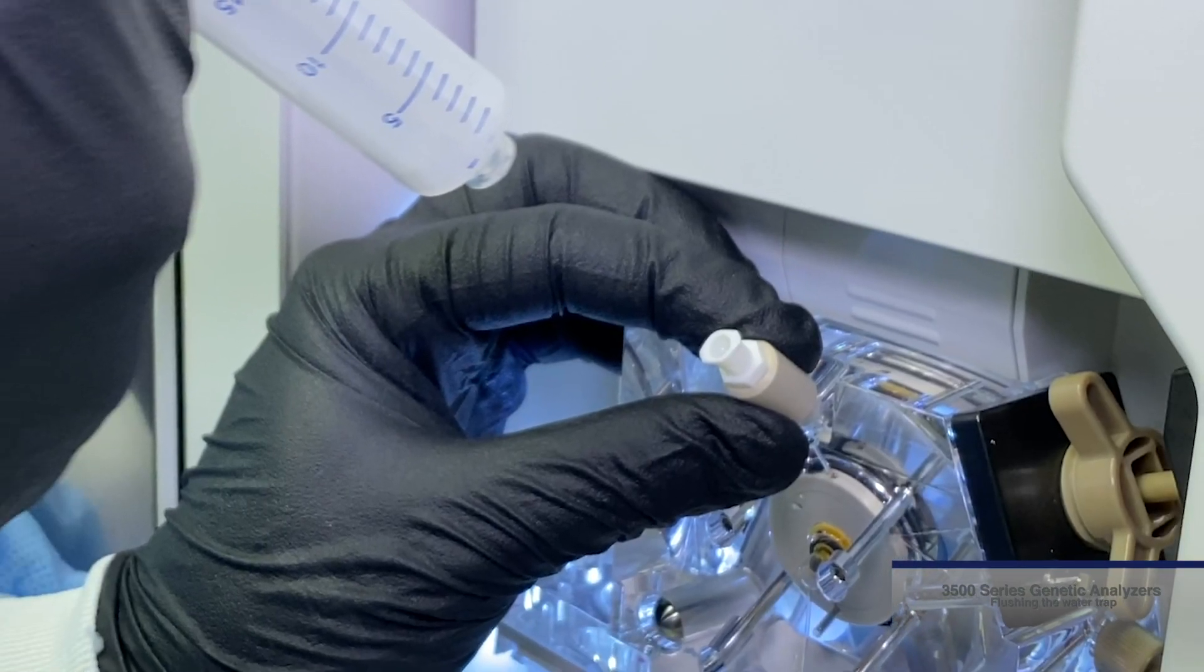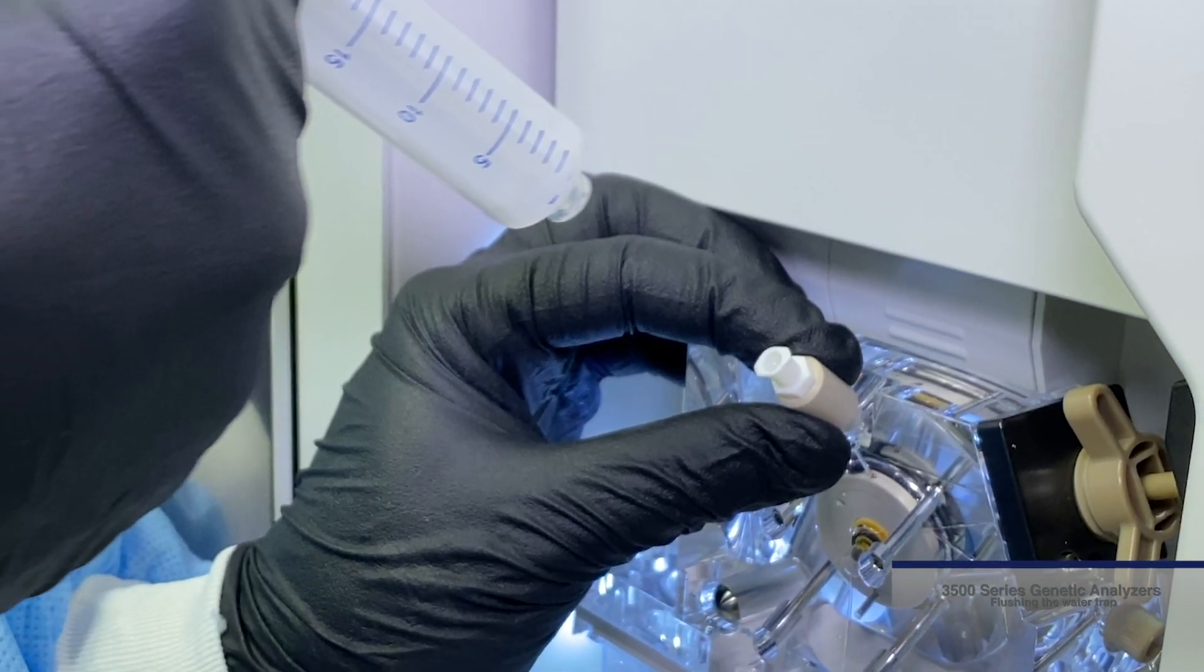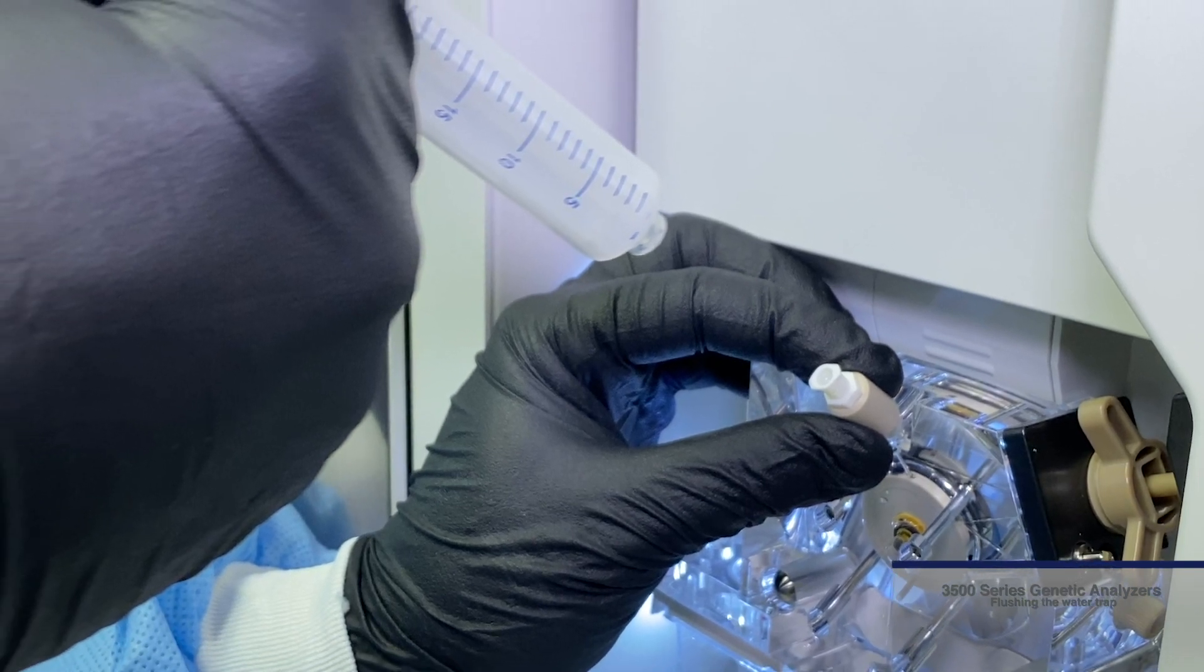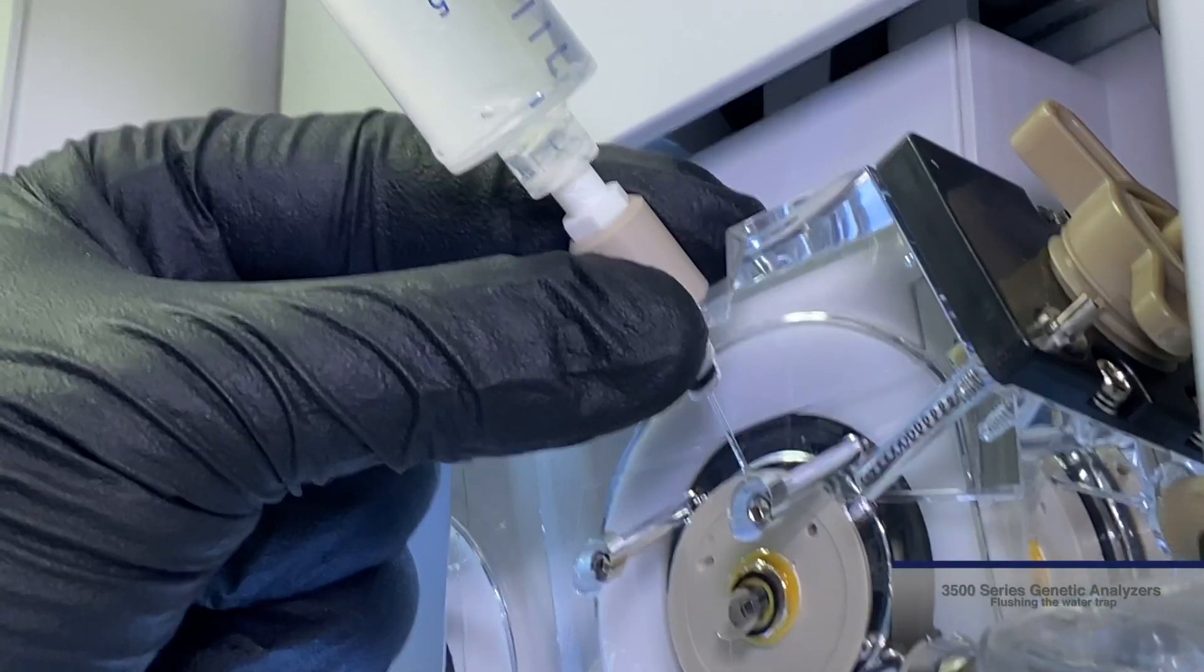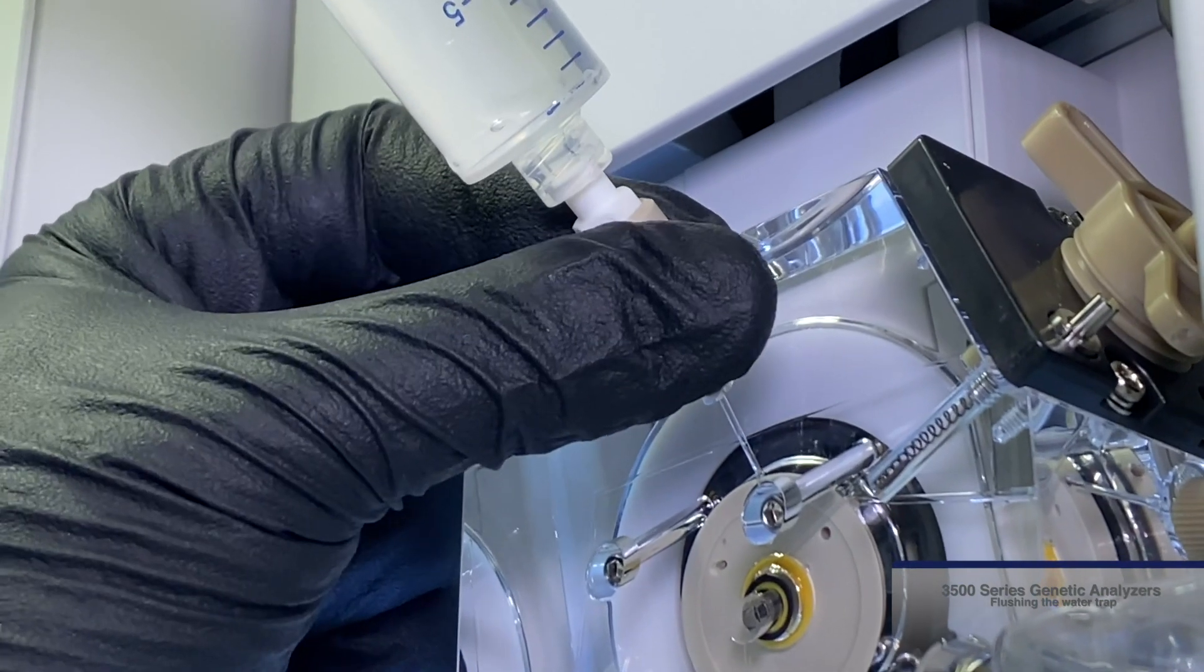Once an adequate volume of water has been run through the water trap, remove the syringe from the lure fitting. Hold the fitting with one hand while turning the syringe counterclockwise with the other hand.